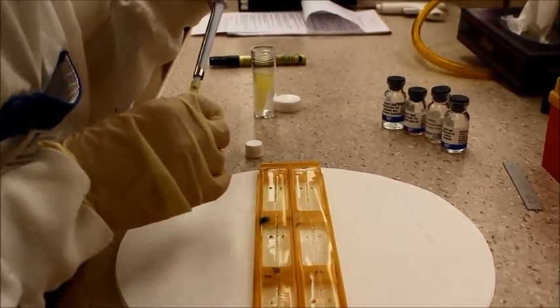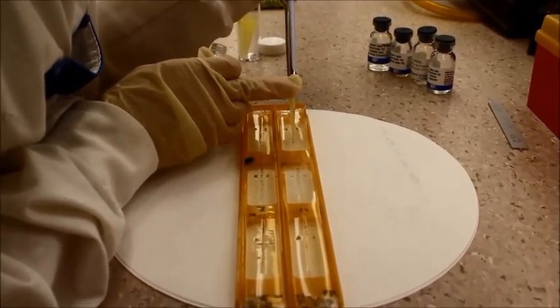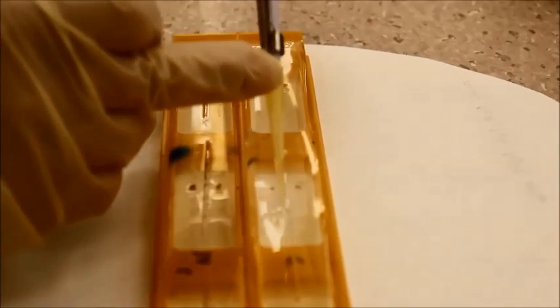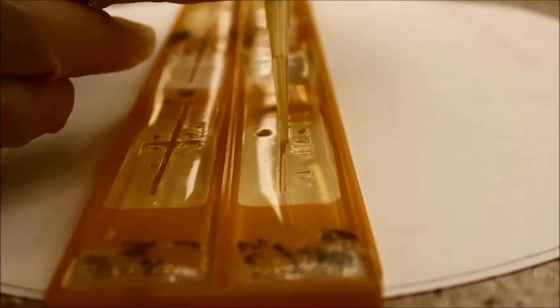Fill one pair of troughs with 100 microliters of anti-human whole serum, the second pair with 100 microliters of anti-human serum albumin, and the third pair with anti-human immunoglobulin.